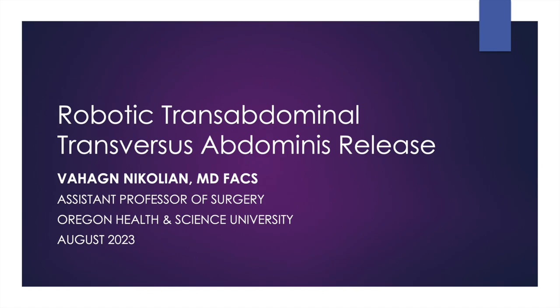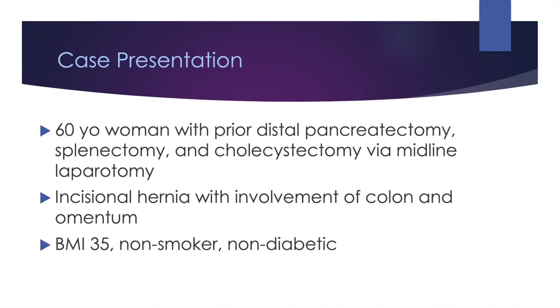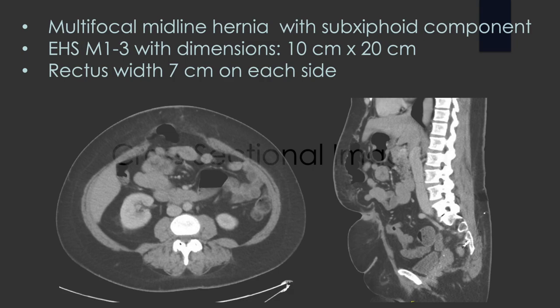Welcome to another installment of robotic hernia surgery. Today we're talking about robotic transabdominal transversus abdominis release. This is a case of a 60-year-old woman with a prior distal pancreatectomy, splenectomy, and cholecystectomy who had a midline laparotomy and an incisional hernia. She had a BMI of 35, was a non-smoker and non-diabetic.